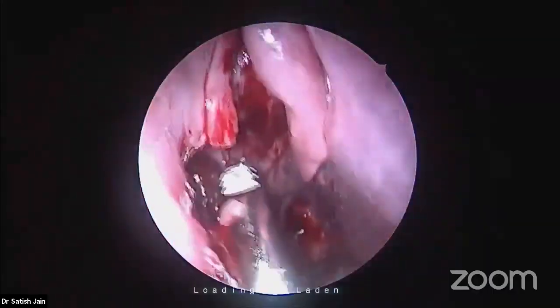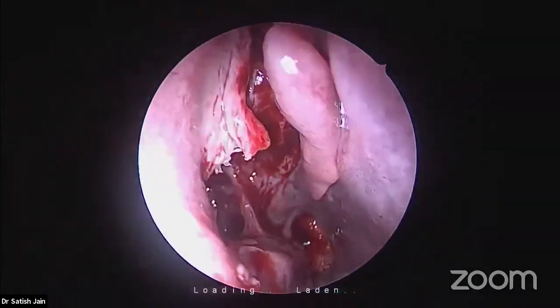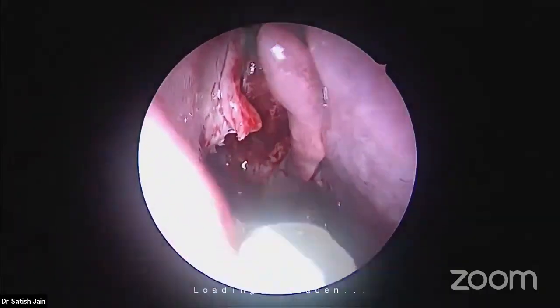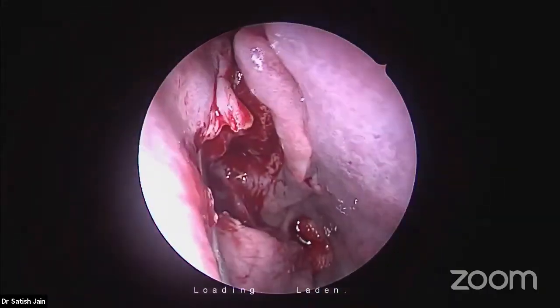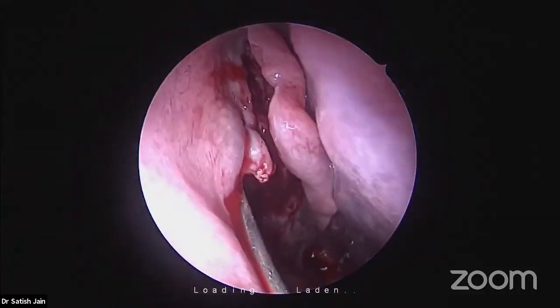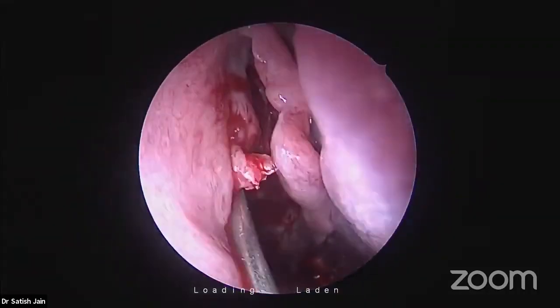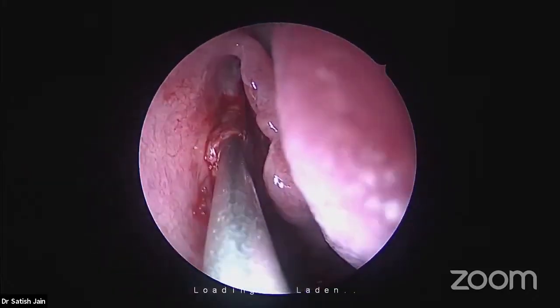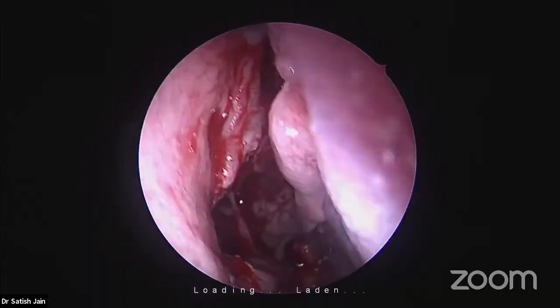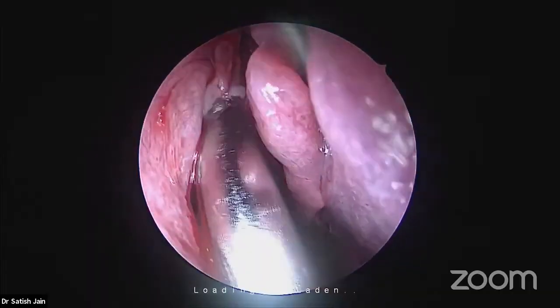Now the second part. This is my uncinate. I told you my concern is this uncinate is immediately medial to the orbit. See this upper part of the uncinate, what I'm doing, going behind with the angled curette, coming anteriorly. Every movement should be anterior, away from the structures behind, to prevent damage. Once you dislodge it, you can debride it.